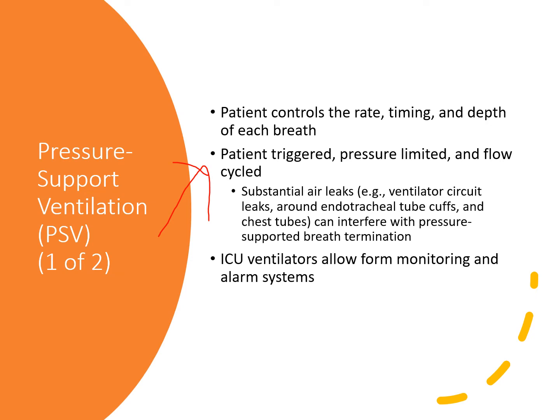Well, you're going to look at the airway resistance. Typically, pressure support of 5 to 15 is appropriate for weaning criteria. So if a patient has very high airway resistance, they'll need more pressure support, or with very low airway resistance, they may not need as much support. They might just need a little bit, 5 centimeters of water, right?